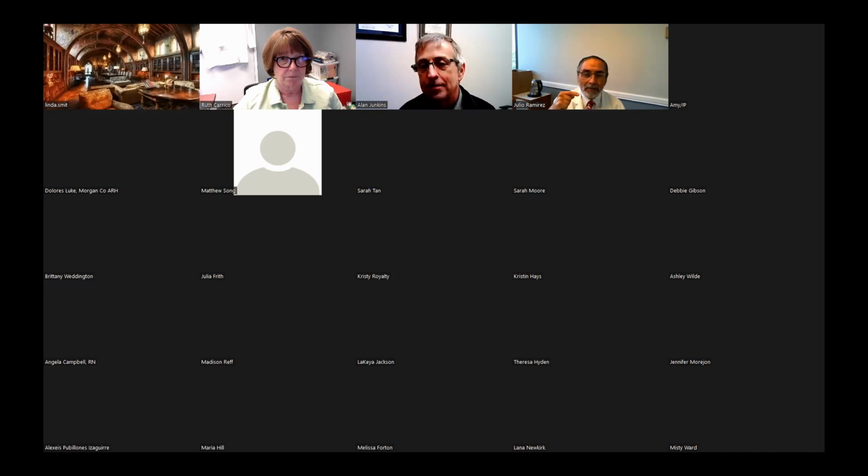Then it's a matter of calling you, and you say, okay, I'm going to do an E-test to see if the MIC is 16 or 32 or 64 or 200, because if it's 200 something, I will never get there. If it's 32, I can play around with the dose and do something. Then the question is, how long does it take once we call? In this case, we really want to know it's resistant, but we really want to know the MIC. How long does it take for you to get it?